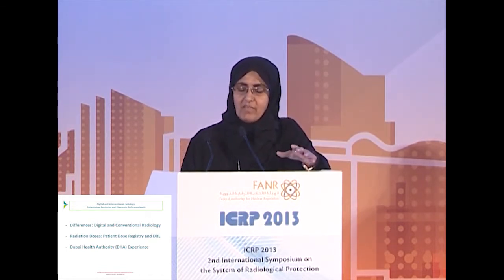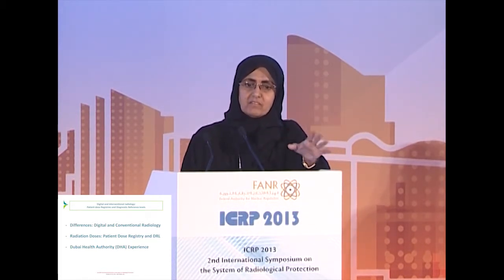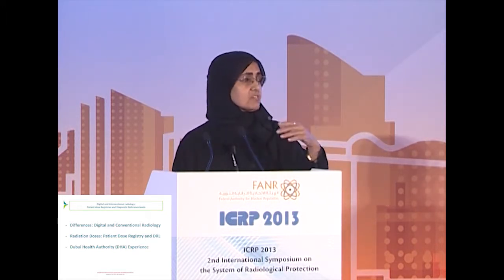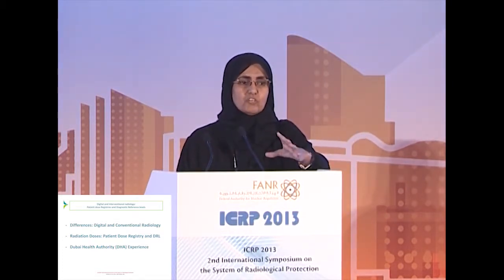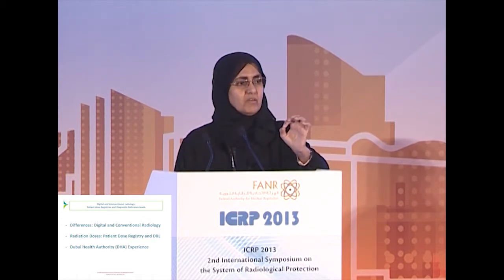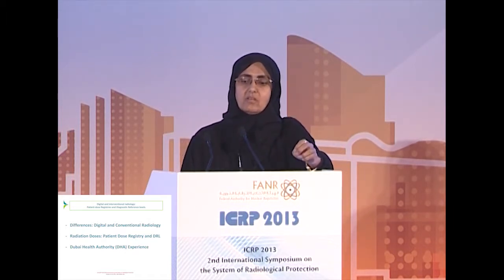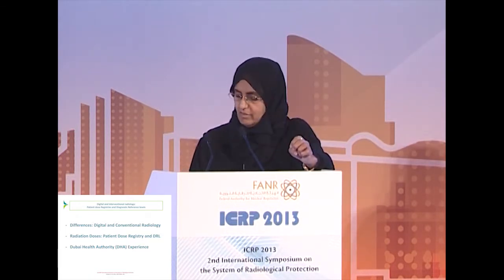But saying that, there is still a risk of overdose or overexposure in the DR system compared to conventional radiology. In conventional radiology, it's very easy to see overexposure or underexposure because of the black or white of the film, while in digital radiology, it's difficult to observe this very quickly unless you have a system of monitoring and auditing. So that's why radiation dose registry and DRL are very important in digital radiology.